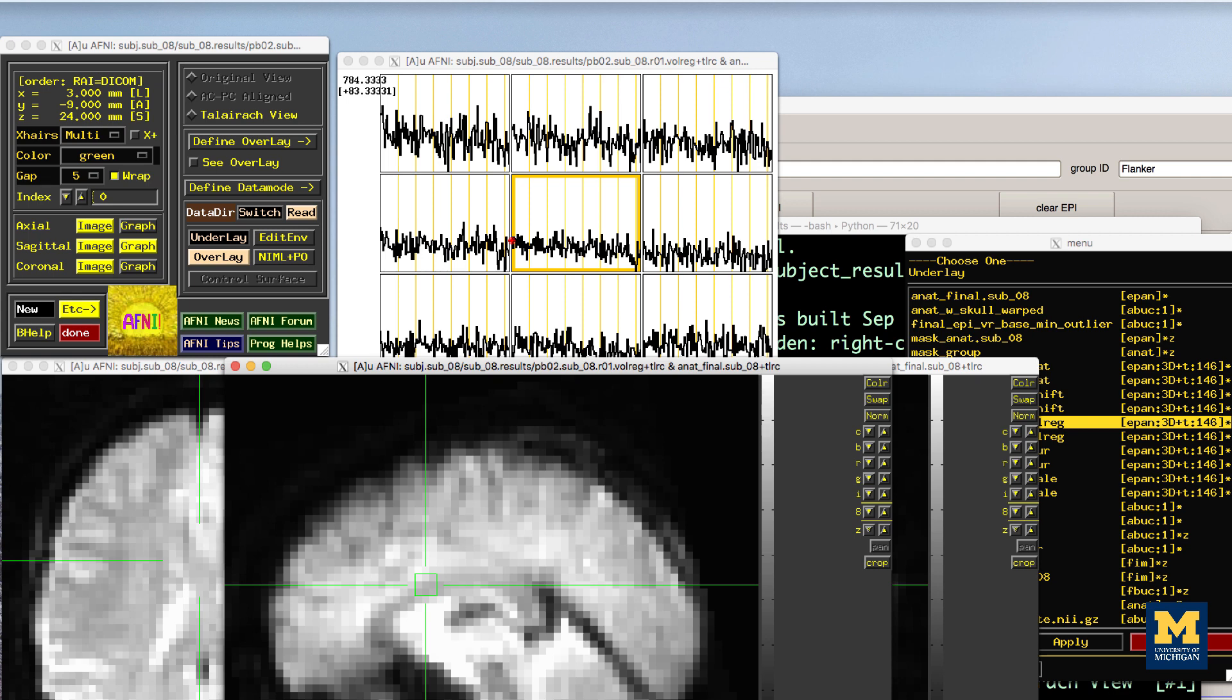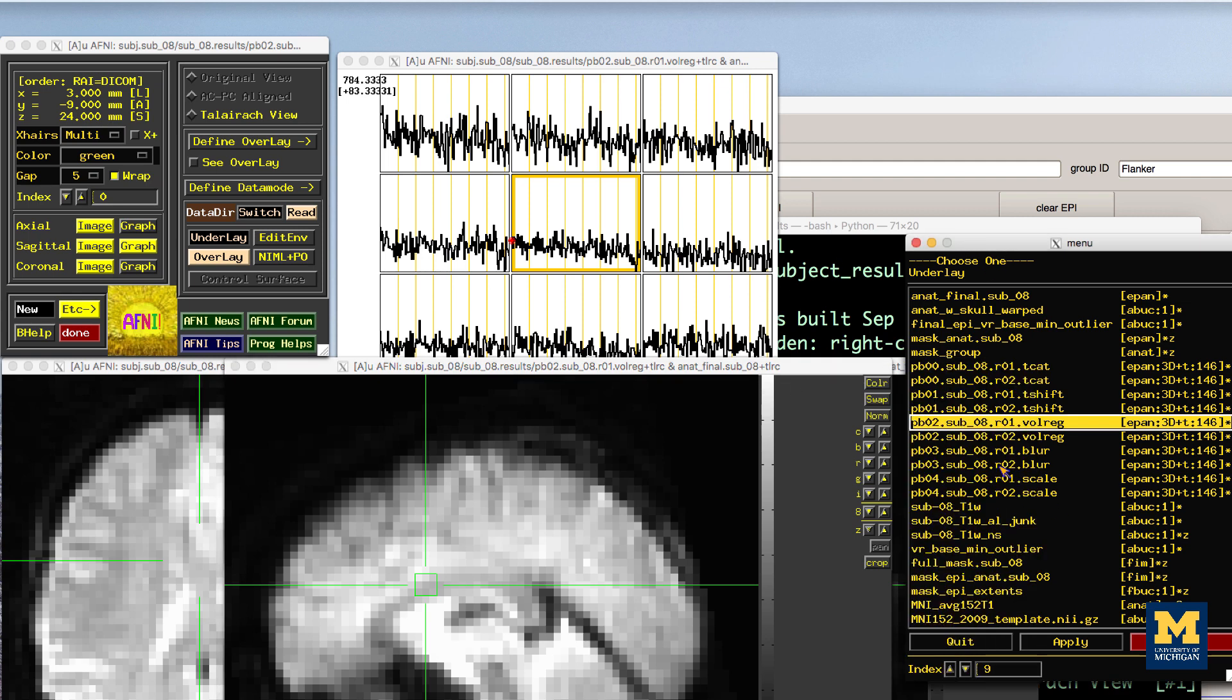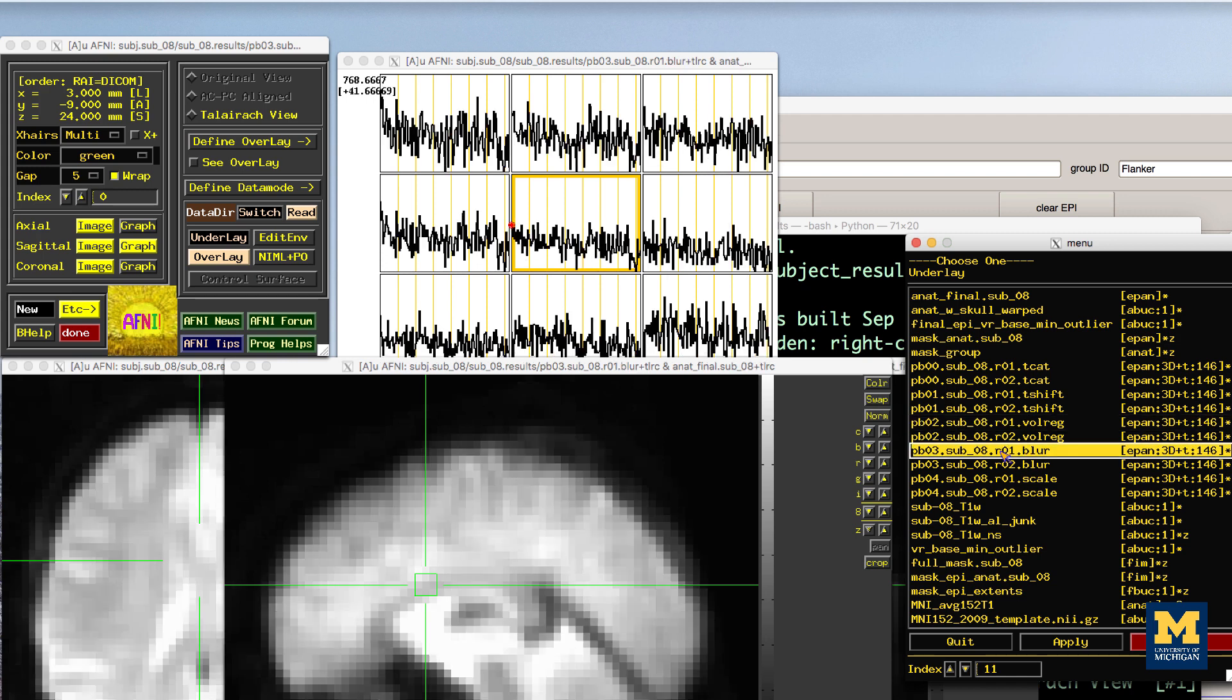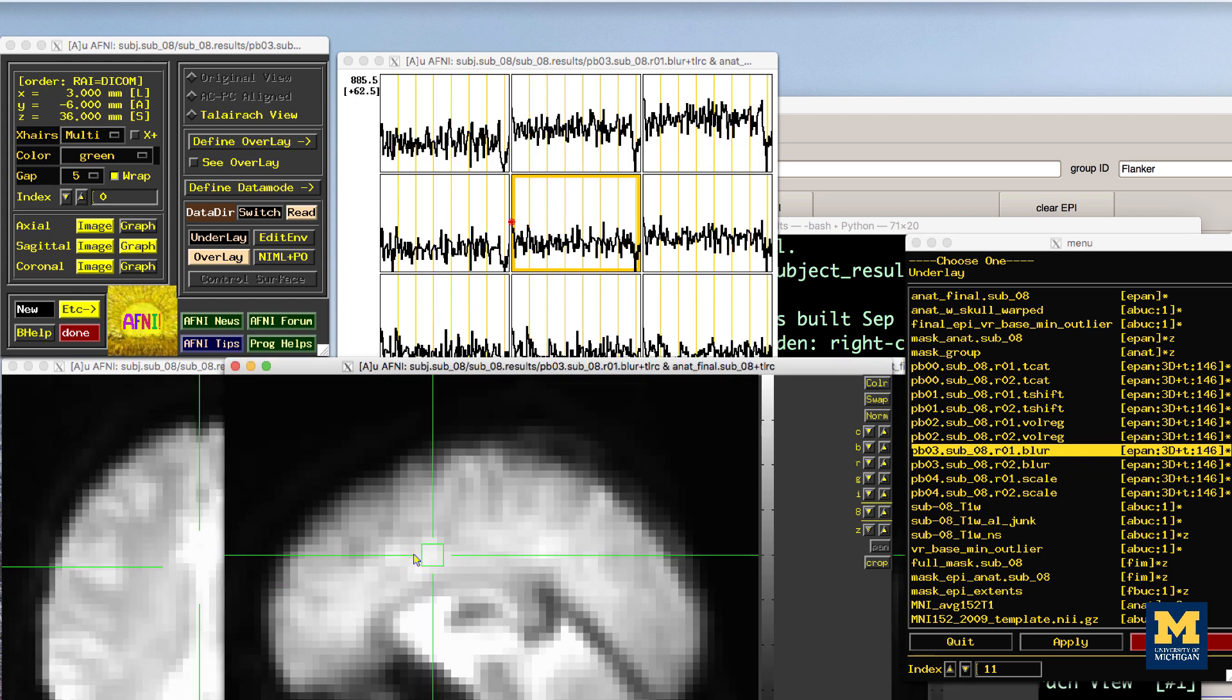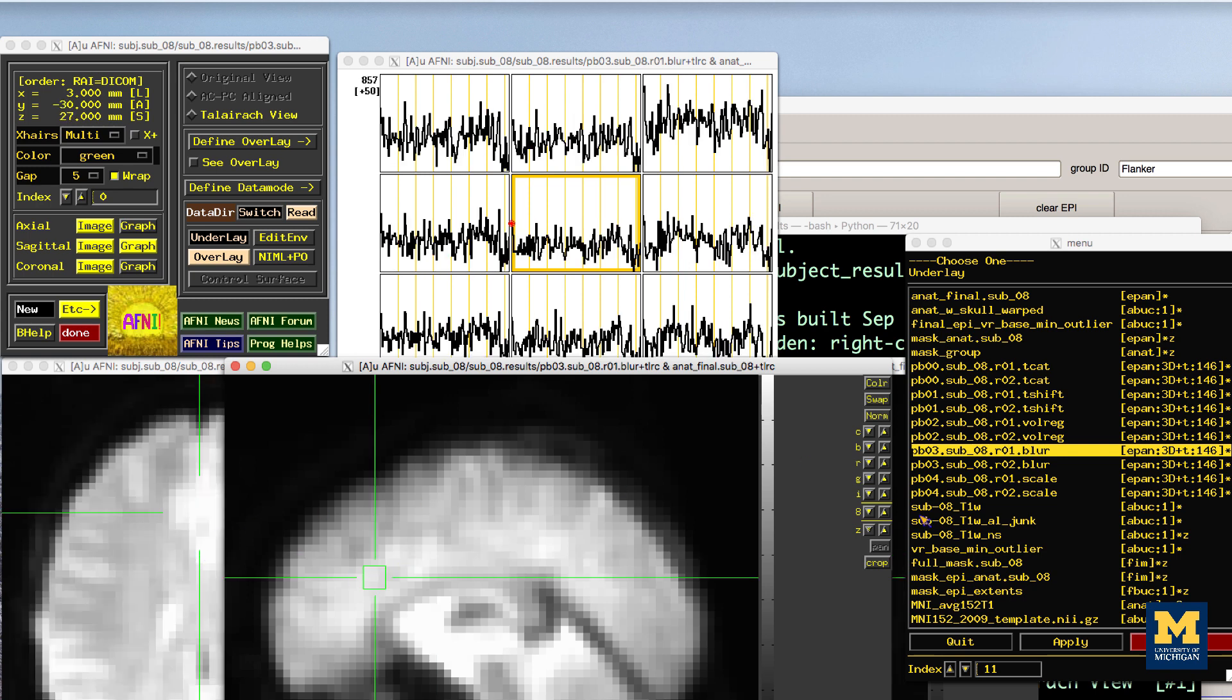Processing block 3 is smoothing, which averages the signal of the nearby voxels together in order to increase signal and cancel out noise. These images will look more or less blurry as a function of the size of the smoothing kernel that you apply to the data. In this case, a smoothing kernel of 4 millimeters will blur the data slightly, but not by much. Look at the images to make sure that the blurring looks reasonable for this smoothing kernel size.